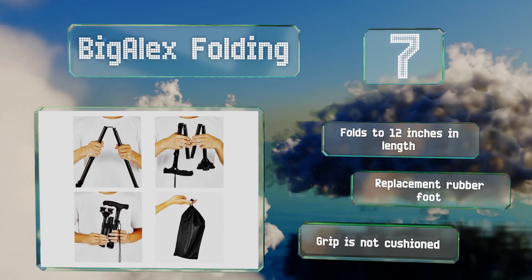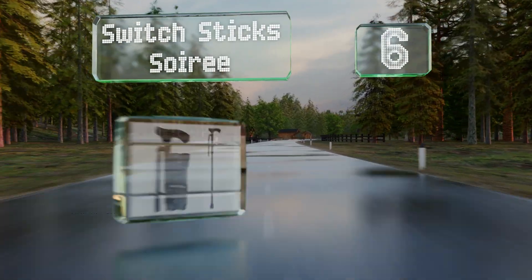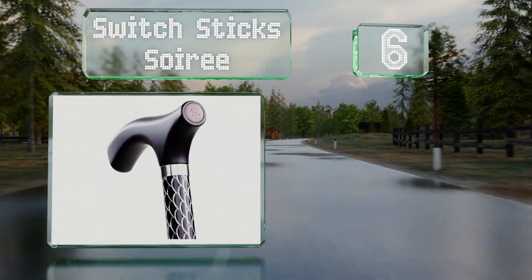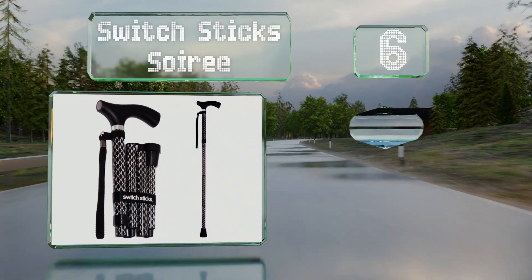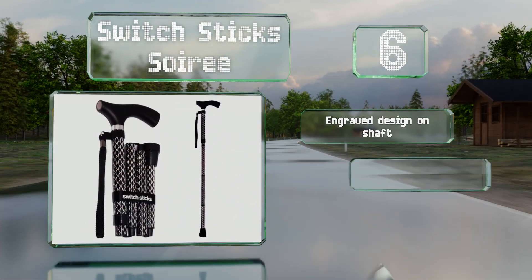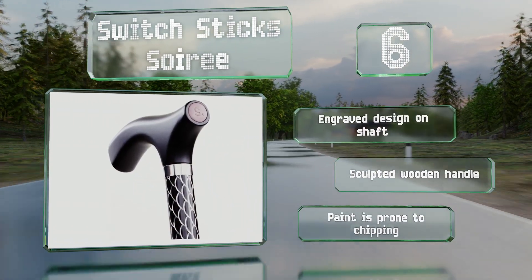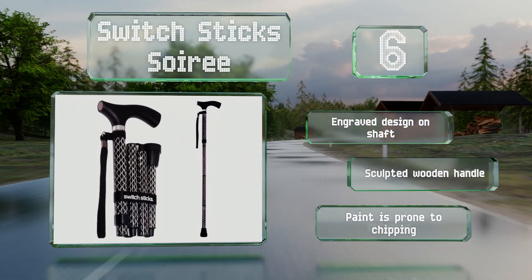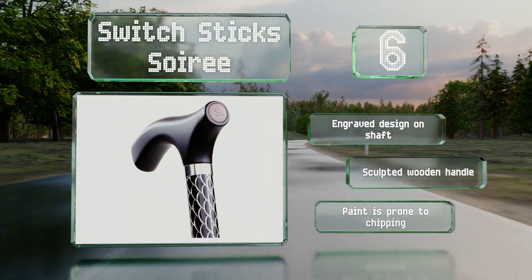Moving up our list to number six, the Switch Stick Soiree folds down to 11 and a half inches and comes with a water-resistant carrying case. It's lightweight at just 13 and a half ounces, and the height is adjustable from 32 to 37 inches. It comes in an attractive gift box and supports an engraved design on the shaft and a sculpted wooden handle. However, the paint is prone to chipping.